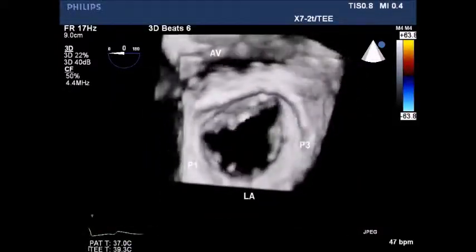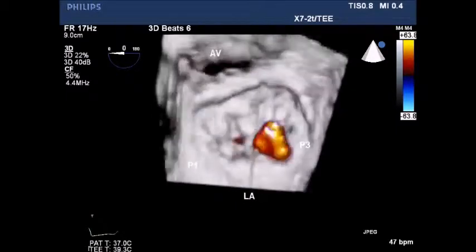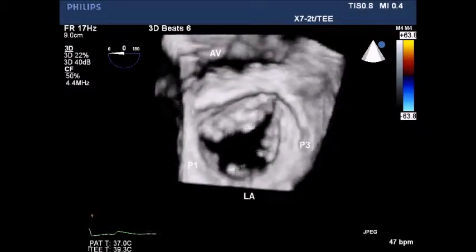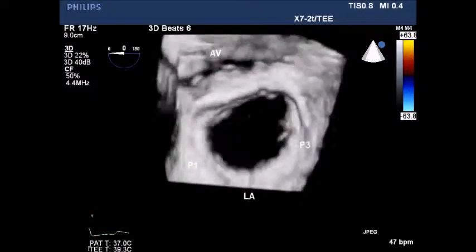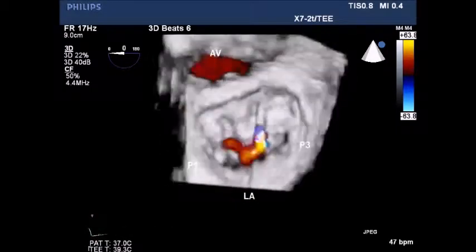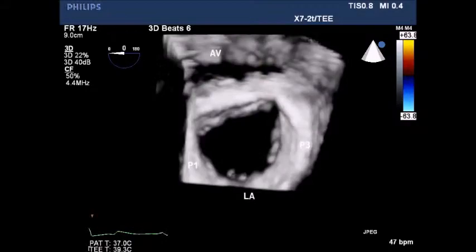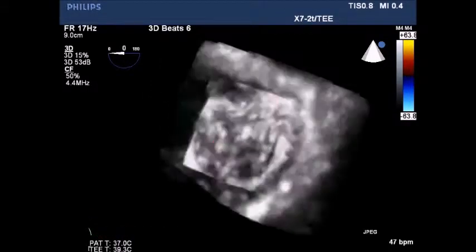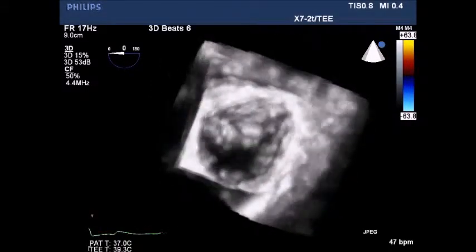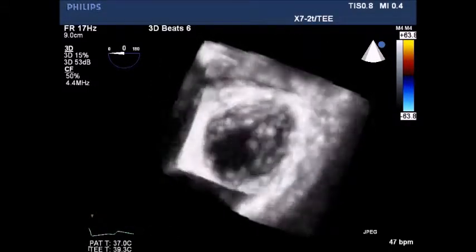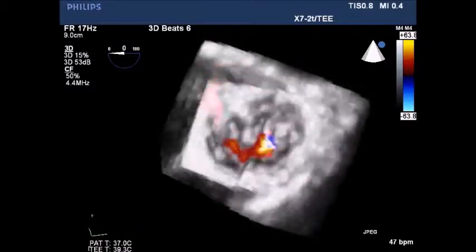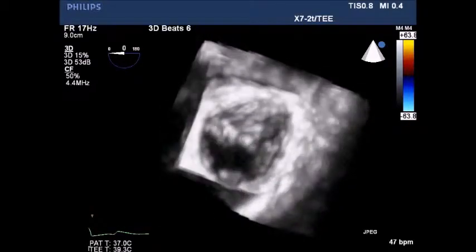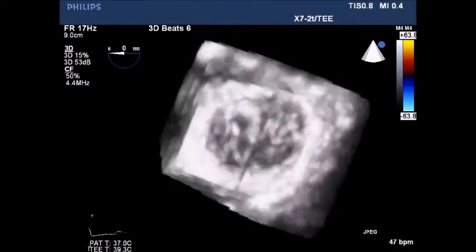Color Doppler showing a mild mitral insufficiency. Two small jets are visible between the 1 and 2 region and between the 2 and 3 regions. Color with a different transparency pattern again showing mitral insufficiency.